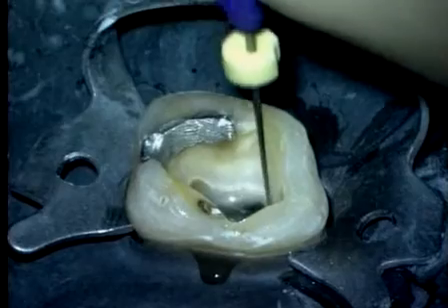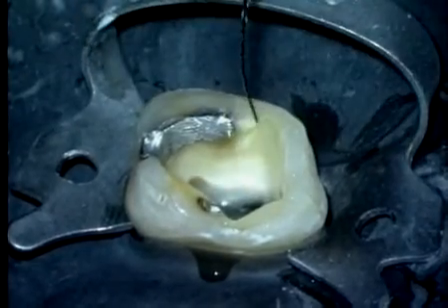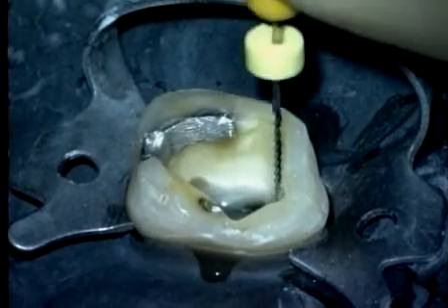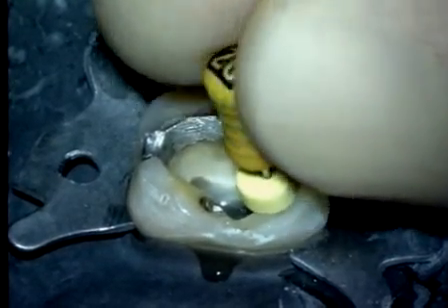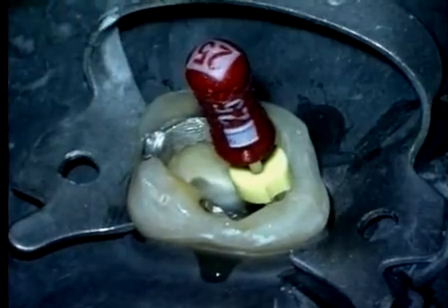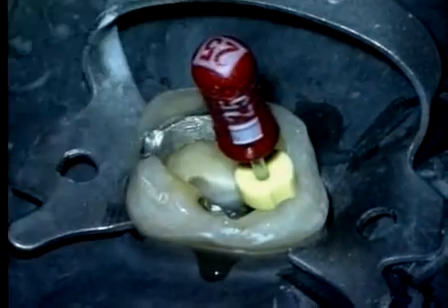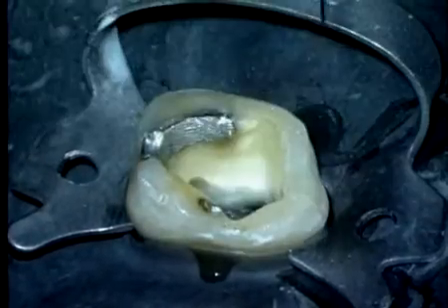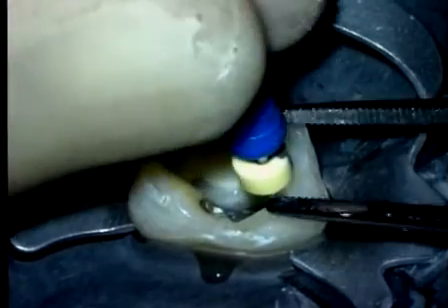Following the use of finisher 1, which was a 20 at D0 and has a 7% taper, it's time to gauge. Gauging is accomplished by using an ISO .02 tapered 20 hand file. If the 20 hand file is snug at length, we're ready to pack. For first-time ProTaper users, it's important to appreciate the kind of shape that was just cut, and we can do this by using a series of ISO .02 tapered hand files.